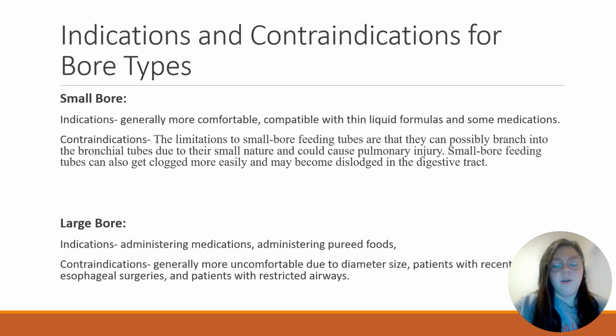Large bore feeding tubes are important and imperative for administering medications and pureed foods. However, they're generally more uncomfortable due to their diameter and size, and they're not indicated for patients with recent esophageal surgeries or with restricted airways.